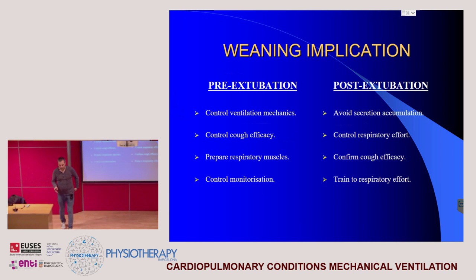But we can also separate, because we are important during the whole intubation phase, but we have a specific role during the weaning process. And in fact, we have a role during the pre-extubation moment and just after, in the post-extubation phase.